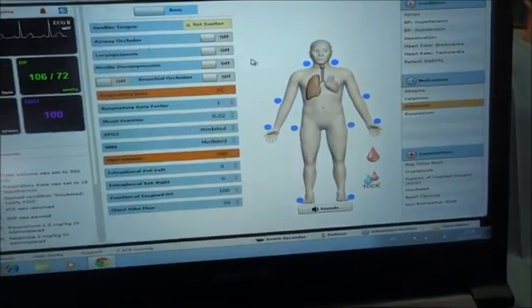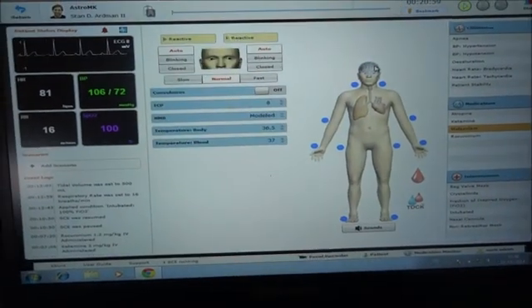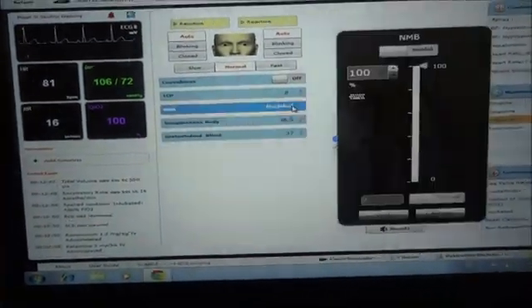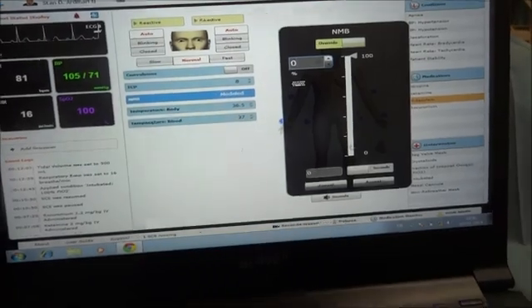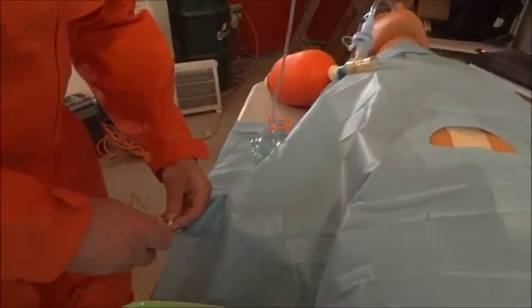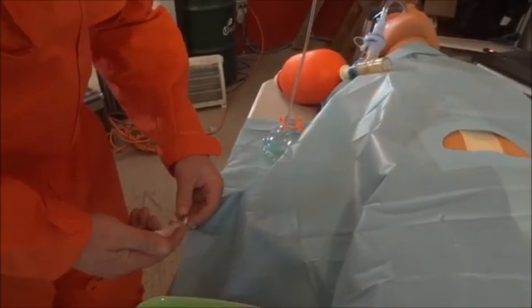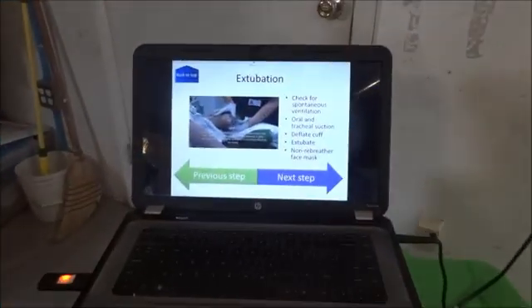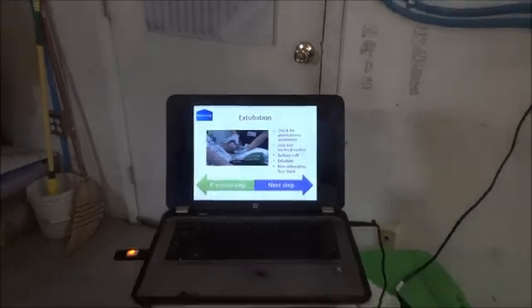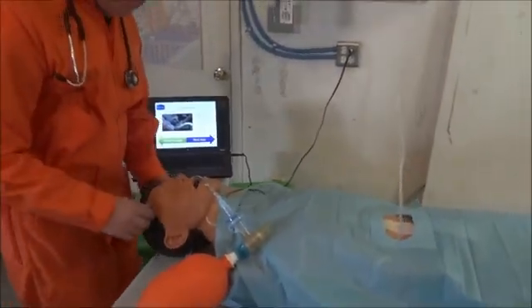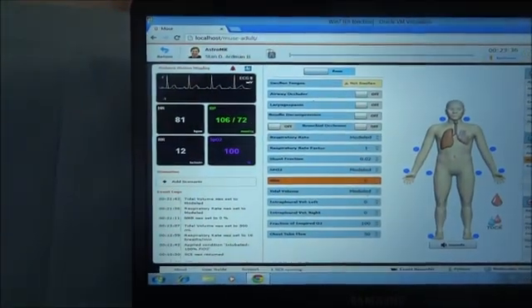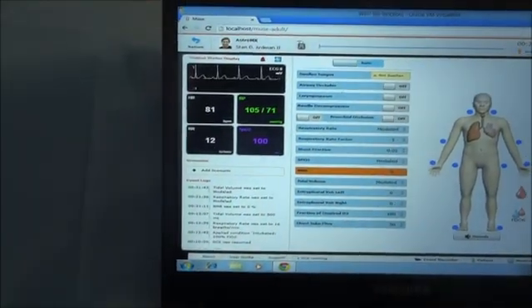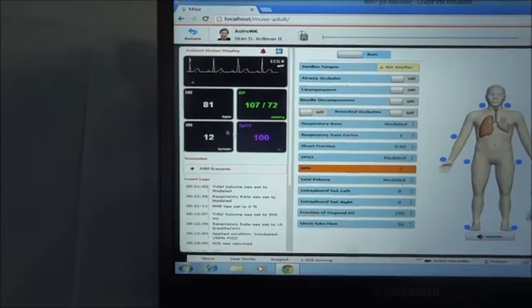Let's reverse the anesthesia by injecting some Sugamadex. At the same time on the simulator, I'm going to reverse the muscle blocker effect by putting the NMB — neuromuscular blockade — to zero, while the participant is injecting the Sugamadex. The final step of the procedure is to extubate the patient. The participant checks for spontaneous ventilation — he's actually breathing. Now that we've reversed the effect of the muscle blocker, the respiratory rate is at 12 per minute. Saturation is normal and hemodynamic status is good.